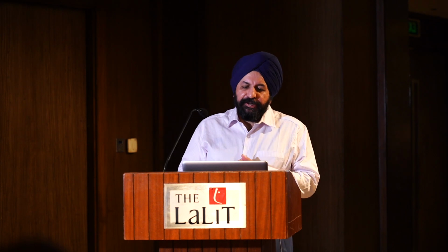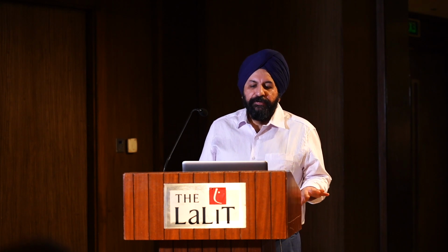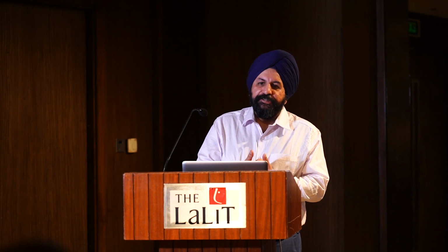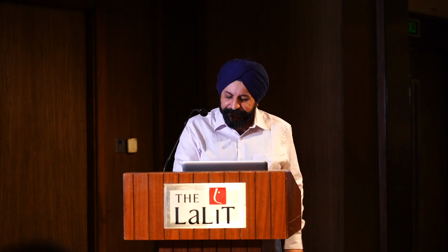The peak IPF value ranged from 5.5 to 38.7 with a mean of 13.5 and standard deviation of 6.4. One thing was very clear, we cannot set a ballpark figure for IPF. We have to follow it like a trend analysis. And 86% of patients whose values were over 20% were ethnically from West Bengal, Bihar and Eastern UP, typically the Harris platelet syndrome belt. So I understood pretty early that there is an ethnic component to it as well.